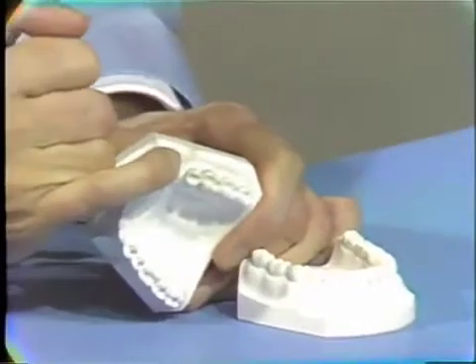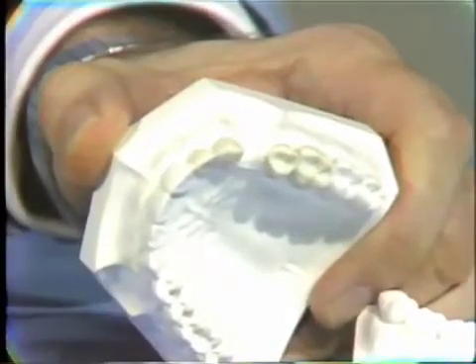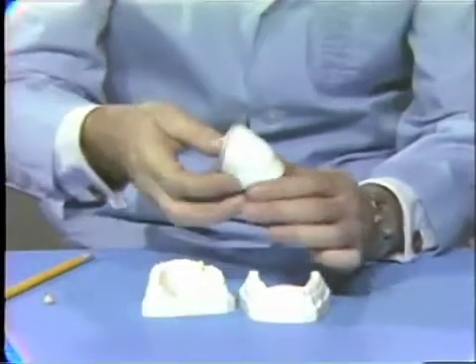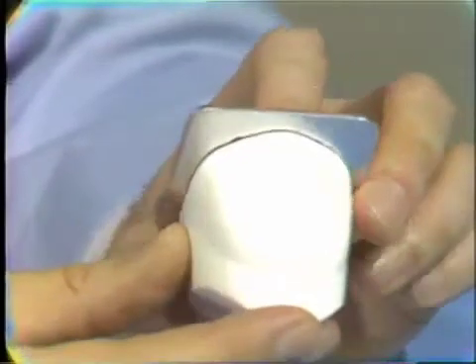The case which we're going to do today, you can see from these models on the bench here, in which the left maxillary first bicuspid tooth is going to be replaced in a test bridge situation. Now, let's take a look at an enlarged model of this type of Trupontic so that we can quickly run through the changes and adjustments which have to be made.